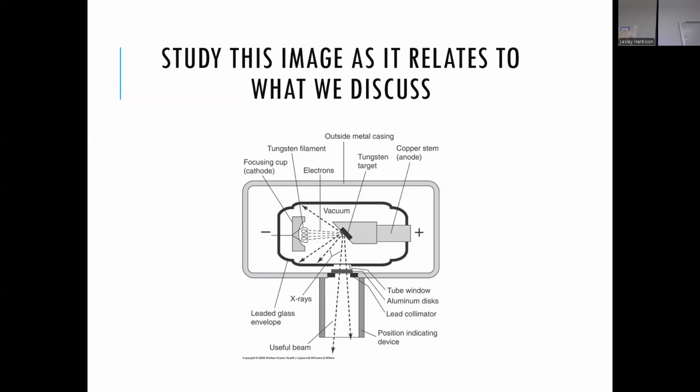So the thing you're actually moving and putting up to a patient's face is not one big glass tube. It's a little glass tube inside, and then it's filled with oil. So the unleaded window is the part that releases the rays? Yeah, so the whole glass tube might even be smaller than that. I have a picture of it, but it's hard to tell exactly how big it is.